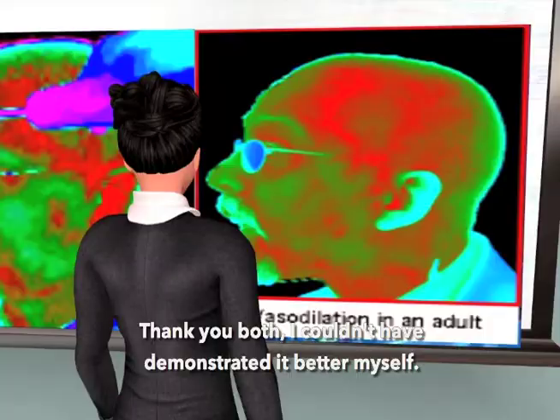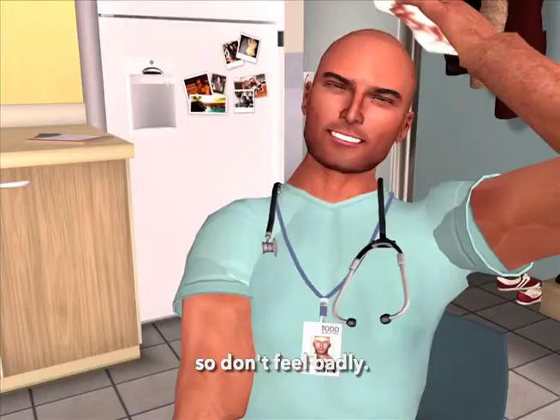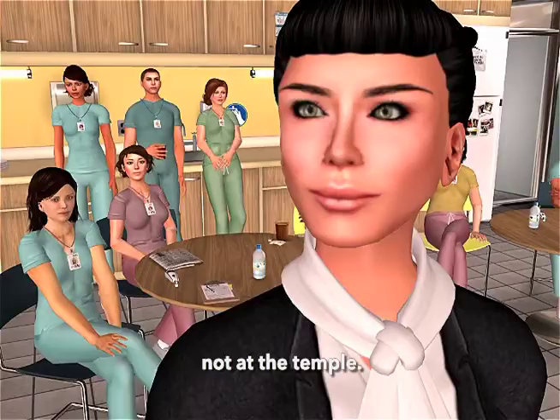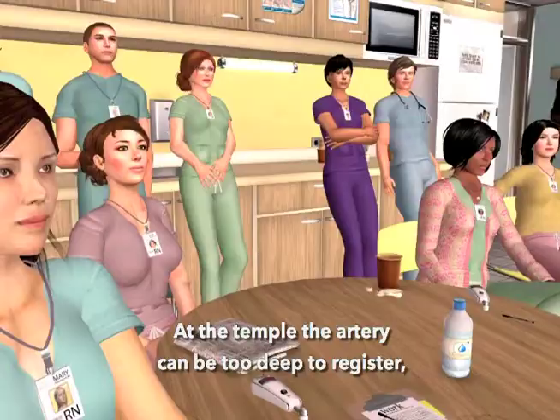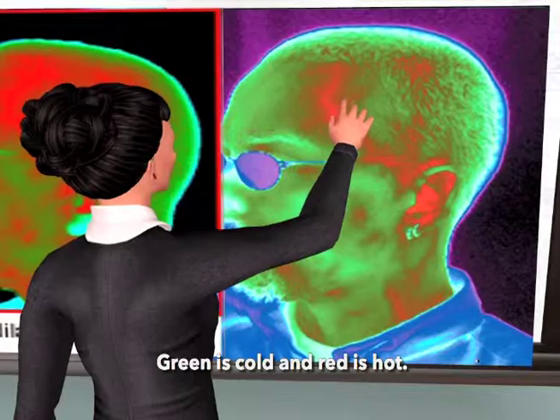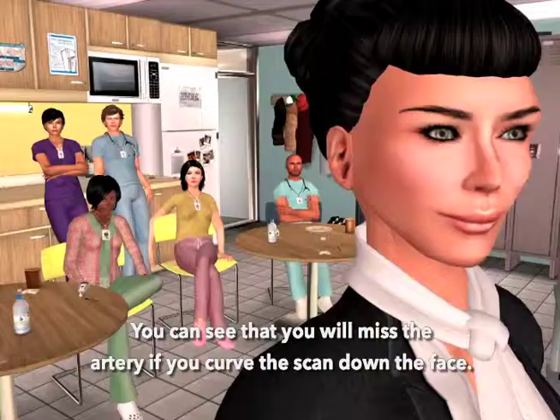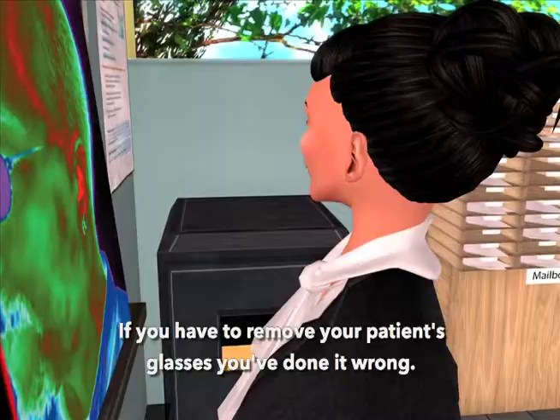Curving down the side of the face is probably the most common error we see, so don't feel badly. Our target is the superficial temporal artery at the forehead, not at the temple. At the temple, the artery can be too deep to register, or you might just miss it entirely. Green is cold, and red is hot — we want the red. A quick rule of thumb: if you have to remove your patient's glasses, you've done it wrong.